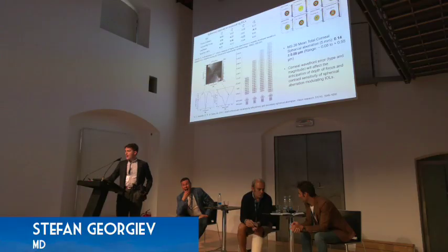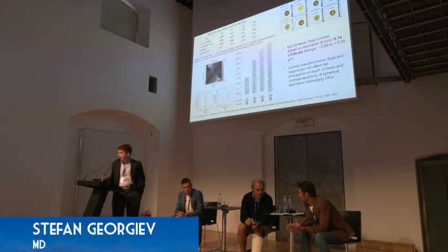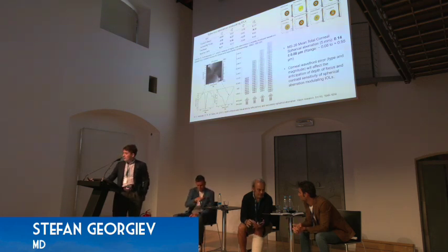When you couple this to the corneal spherical aberration, you'll have a certain amount of variability between patients. This is often treated as a fixed value, but depending on the patient it might not be the case, and it will alter the predictability of depth of focus extension and also visual quality. Because all of these lenses essentially reduce contrast sensitivity one way or the other.